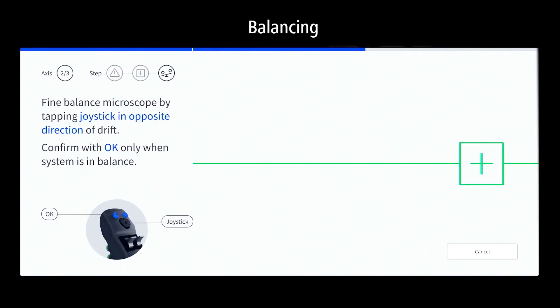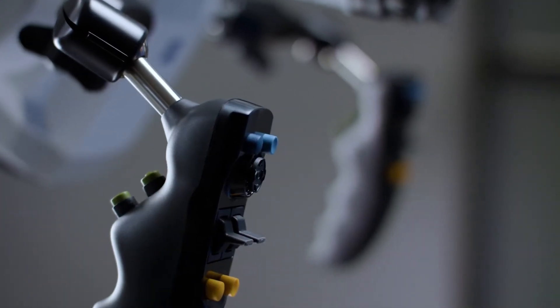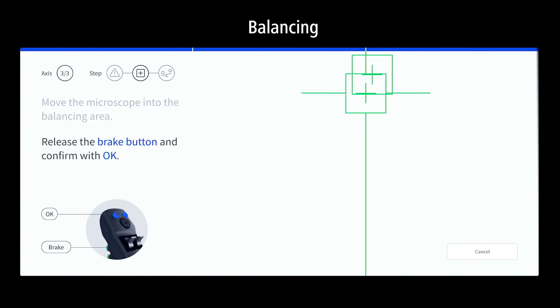Finish the balancing workflow with the last axis by pressing the brake button on the back of the handgrip. Move the system into the balancing area where both crosses align and turn green. Confirm with the OK button.